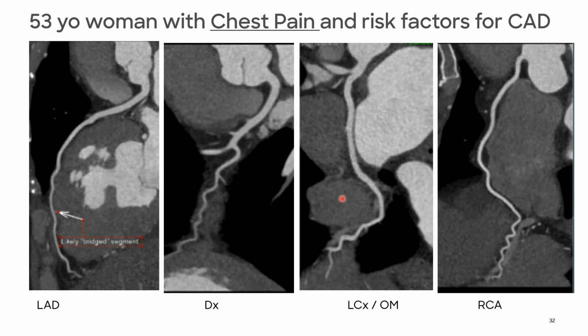And even though it's really nice to be able to see blockages, if someone's pretty sick, we usually take them to the cath lab. If someone is moderately ill, you can make a decision. But if you really want to try and prevent needing to go for an invasive test, there's a lot of people where they're sick enough or they have symptoms that are strong enough that you're thinking about a heart cath, and you can do it in another way and avoid any vascular punctures, some of the complications, and cost and time. And so for a lot of people with stable symptoms, it's a very reasonable test, and we're going to talk about that a little bit later.